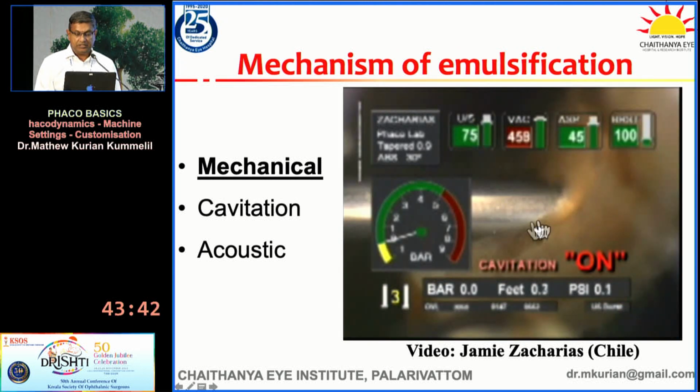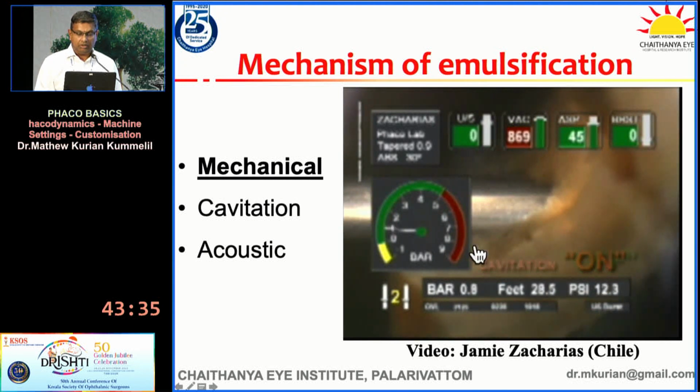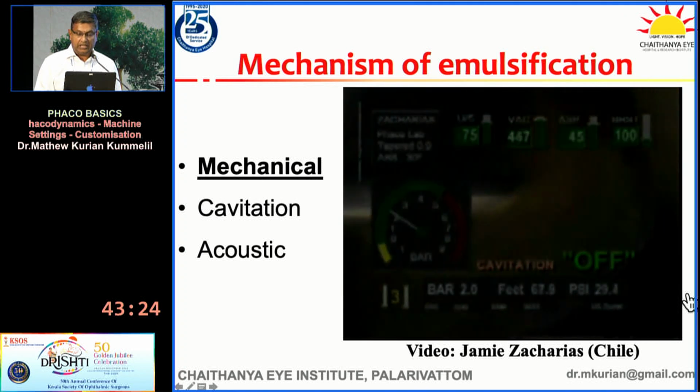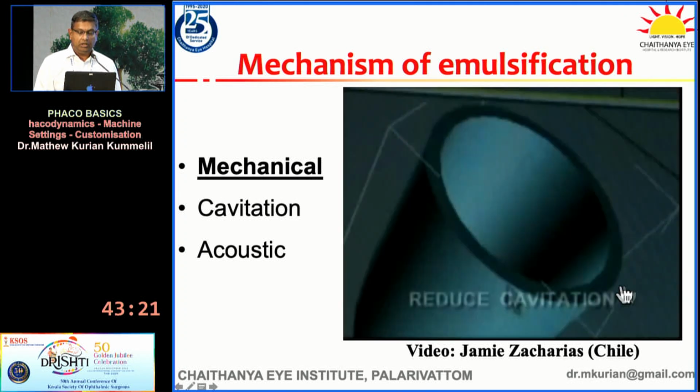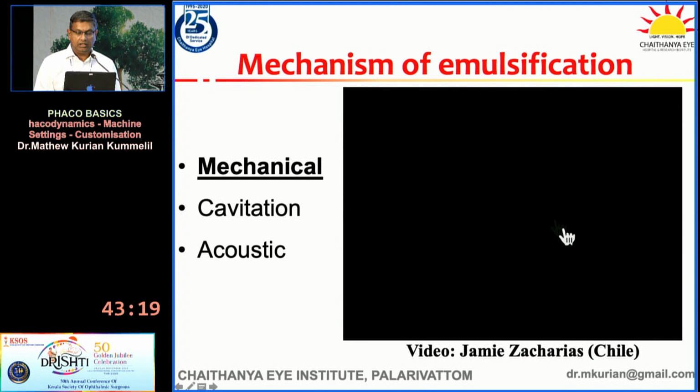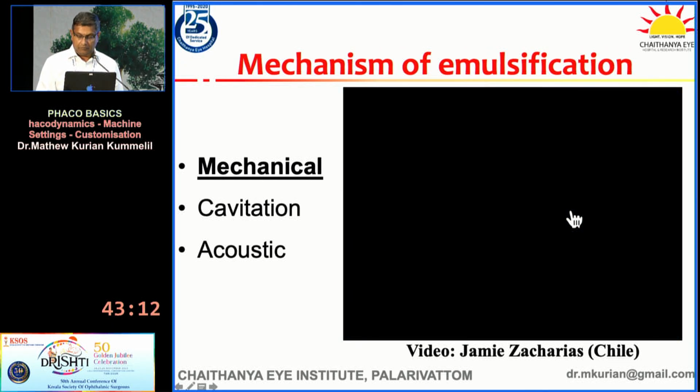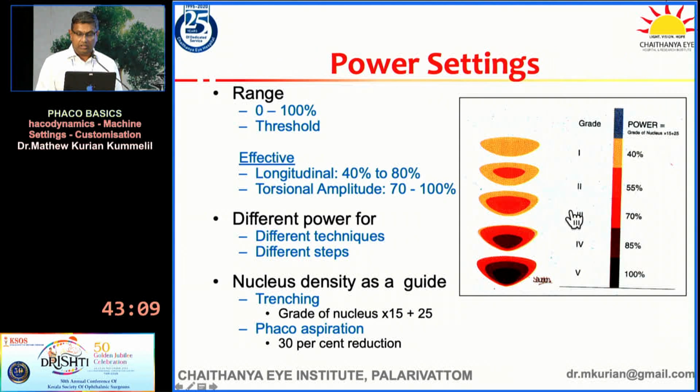So Jamie Zacharias made this award-winning video where he was able to demonstrate that with cavitation, and after increasing the pressure without cavitation, the efficiency of the Phaco tip in emulsifying or embedding into the lens matter was equal. So this was actually a landmark concept because we wanted to maximize the mechanical jackhammer effect and reduce the cavitation, because cavitation is what causes the free bubbles, the free radical formation and damage to the endothelium.